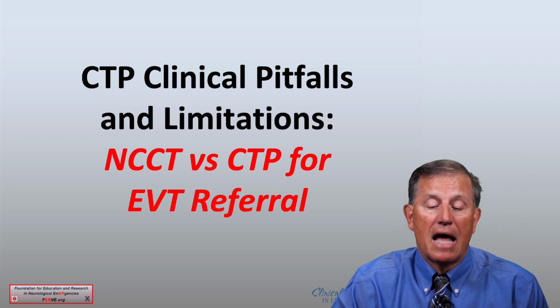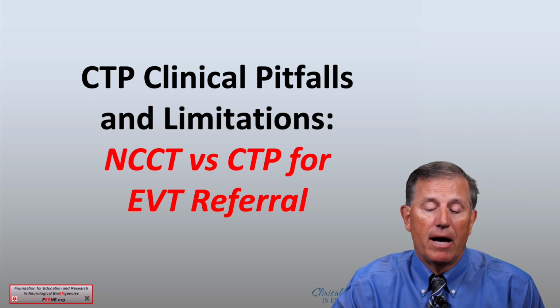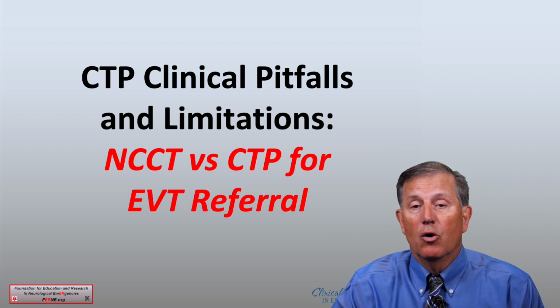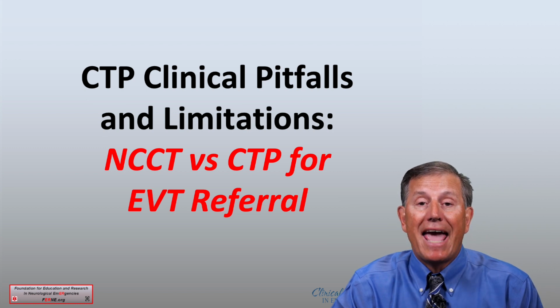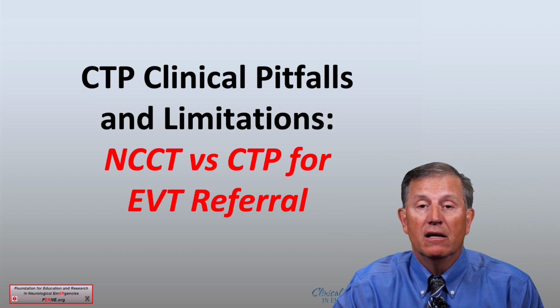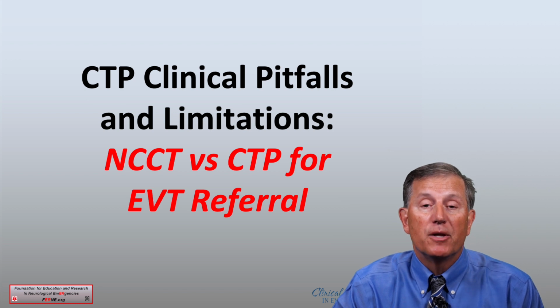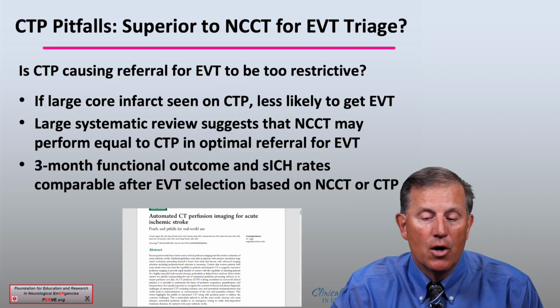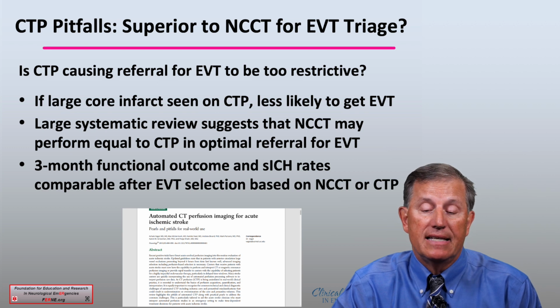One last consideration: non-contrast CT versus CTP for EVT referral. What are we talking about here? In patients who are evaluated in centers that do not have CT perfusion, can you refer patients for EVT accurately and send them to a comprehensive stroke center just from the use of non-contrast CT? So, is CTP causing referral for EVT to become too restrictive? And should we use just an NCCT in order to evaluate for the need for EVT?